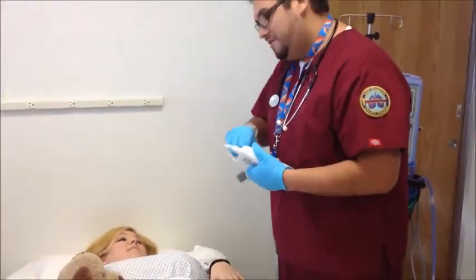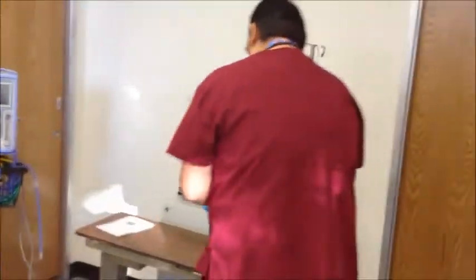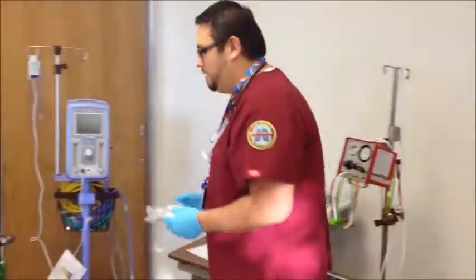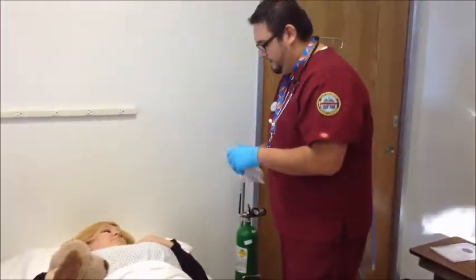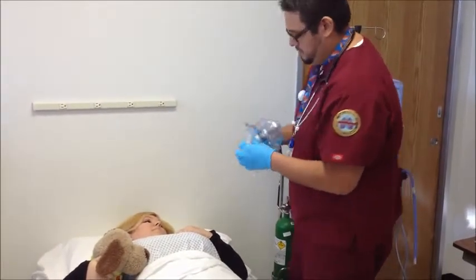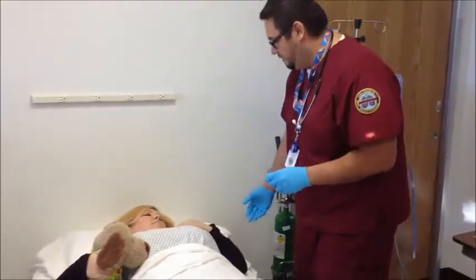Am I going to die? No, you're not going to die if we treat you right. What we're going to do for you is go ahead and give you some oxygen — kind of bring that level back up for us, okay? What I have here is an oxygen face mask. I'm going to have you sit up for a little bit here.